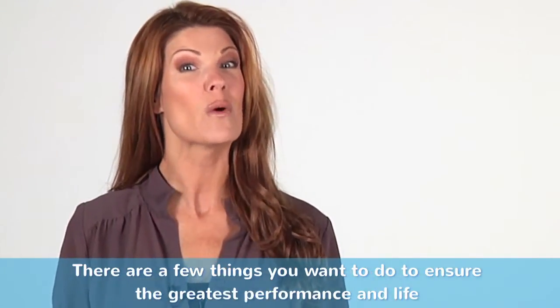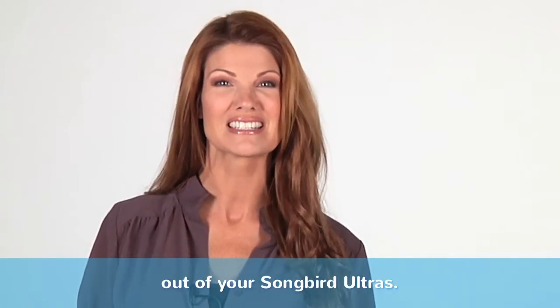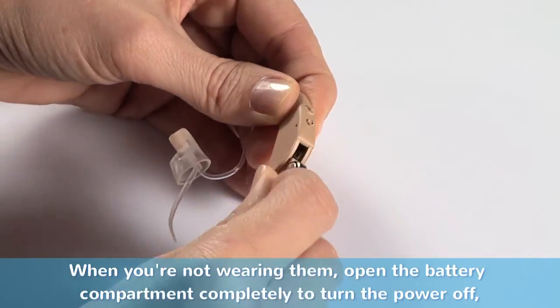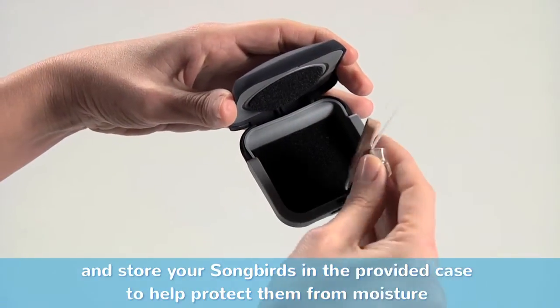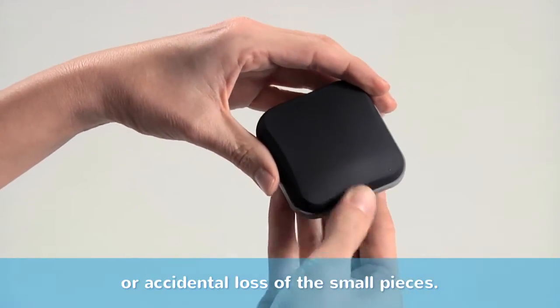There are a few things you want to do to ensure you get the greatest performance and life out of your Songbird Ultras. Make sure to clean your Songbirds weekly. When you're not wearing them, open the battery compartment completely to turn the power off and store your Songbird in the provided case to help protect them from moisture or accidental loss of the small pieces.